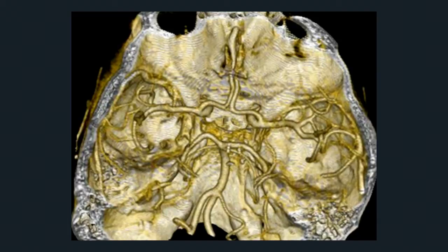The drawbacks of this is that it's a lot of X-ray radiation. We tend not to get too concerned about that, but this gives you much more X-ray radiation than a CAT scan does. The other problem with it is that you need to inject contrast dye into the patient's blood vessels in order to create these images. This means you have to put a pretty large IV into the arm, and you have to inject a whole lot of this contrast material. And this contrast material is then excreted through your kidneys, and it can actually damage your kidneys.